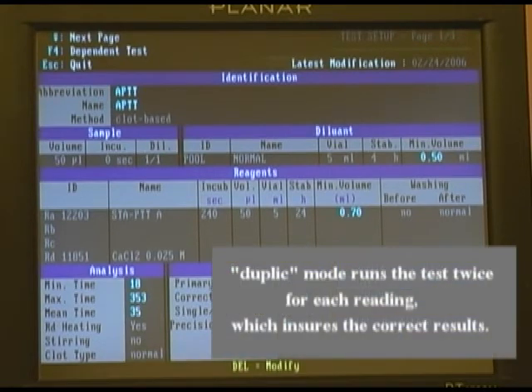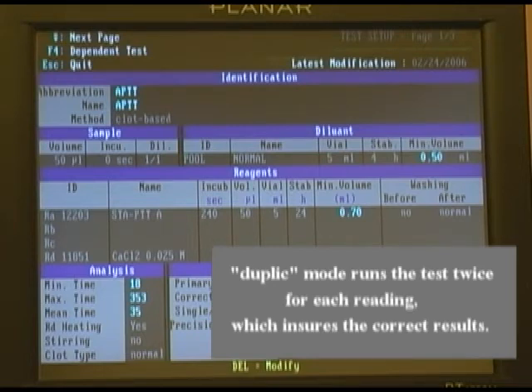This test can also be set up as a single or duplicate — by hitting the delete key we will toggle between those. The precision for this particular test is set at 8%.